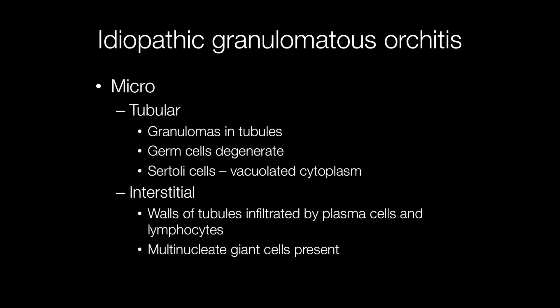Histologically, the seminiferous tubules show germ cell degeneration and the Sertoli cells, which are the supporting cells around the periphery of the tubules, have a vacuolated cytoplasm, and the tubules contain a granulomatous inflammatory infiltrate. The interstitial aspect of the testis shows a lymphoplasmacytic infiltrate with lymphocytes and plasma cells infiltrating the walls of the tubules.